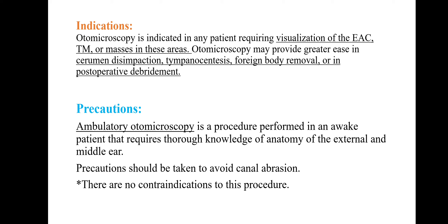Indications: Otomicroscopy is indicated in a patient requiring visualization of the external auditory canal, tympanic membrane, or mass in these areas. Otomicroscopy provides greater ease in cerumen disimpaction, tympanocentesis, foreign body removal, or in post-operative debridement.